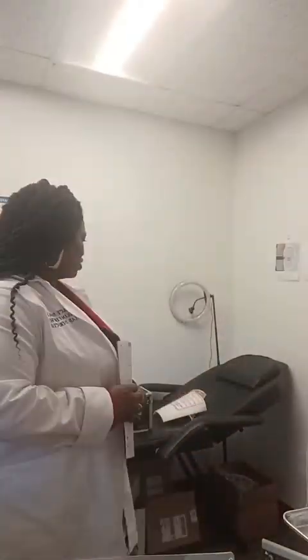All right, and of course you do have to purchase a lockbox, because you do need a lockbox. I prefer the ones with a combination like this because it's going to skip the process of having a key, locking something here and there. You want to have this one. All right, so I'm going to get in the minute and start my specimen collection.